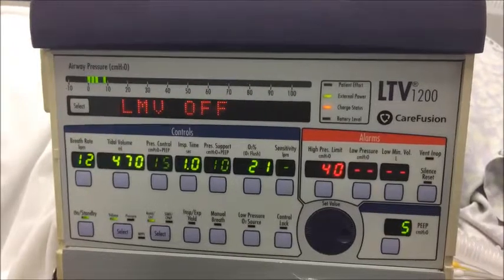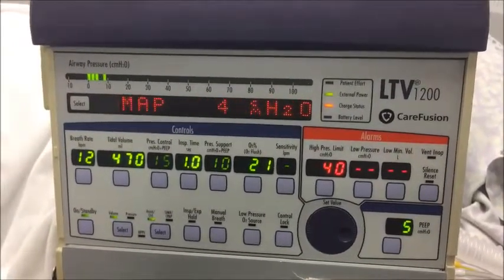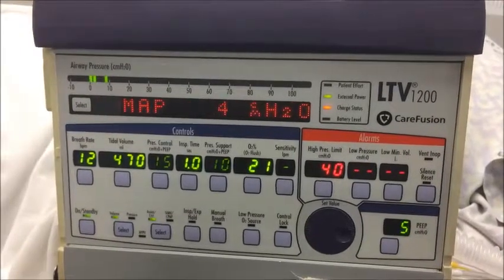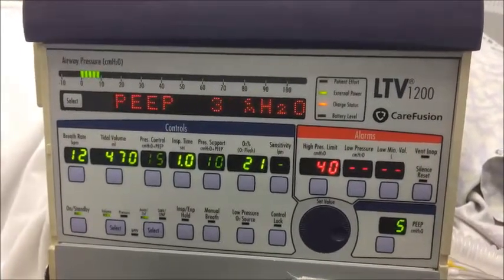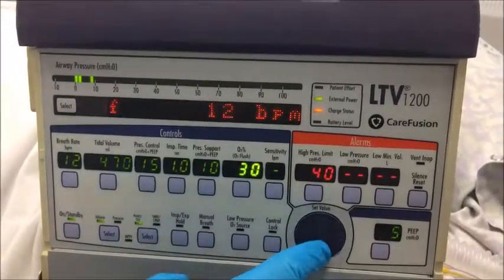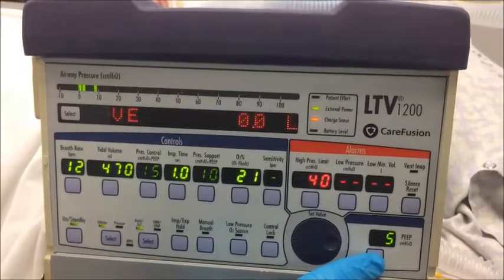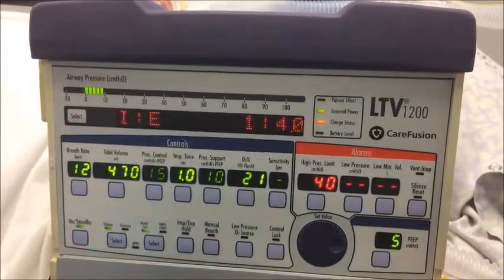Once you've gone through and identified that a change needs to be made to support either oxygenation or ventilation, you'll do so on the ventilator. If you need to adjust the patient's oxygenation, you're going to do so by adjusting either the FiO2 or the patient's PEEP. Increasing the PEEP will help support oxygenation.